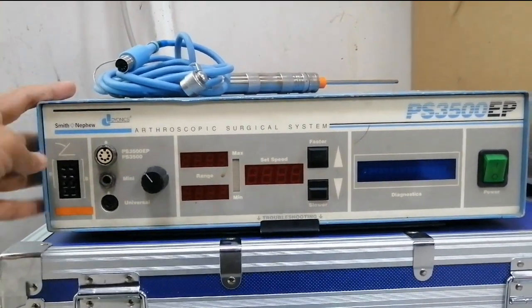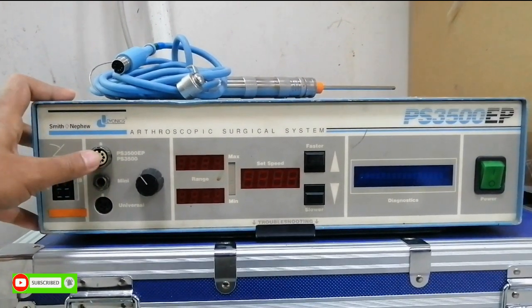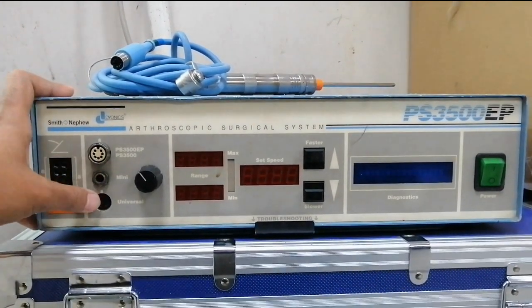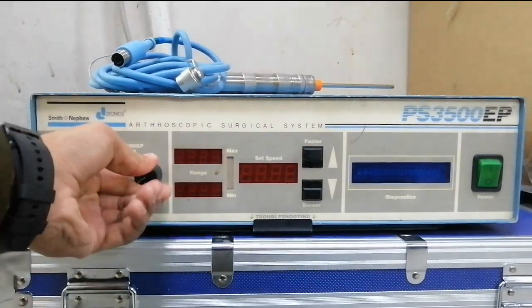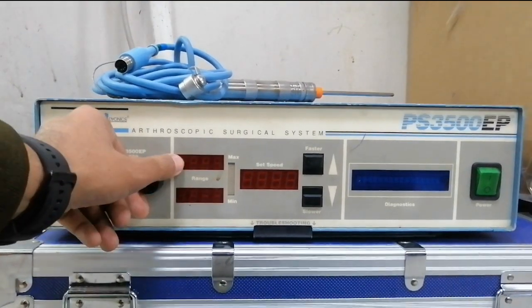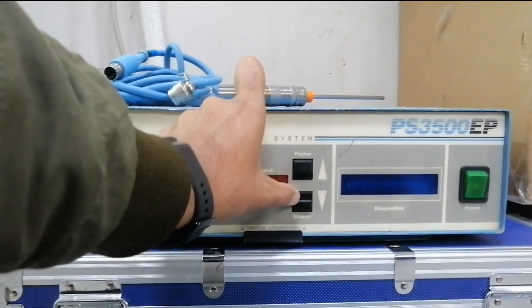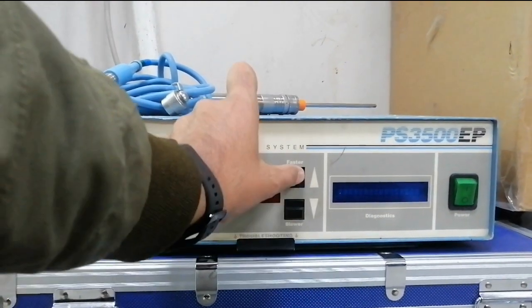Here is the foot switch controller and different handpiece connector switches, and here is the knob to select different handpieces as per our requirement. This indicates the higher and lower speed of this unit — we can select the speed of the unit.